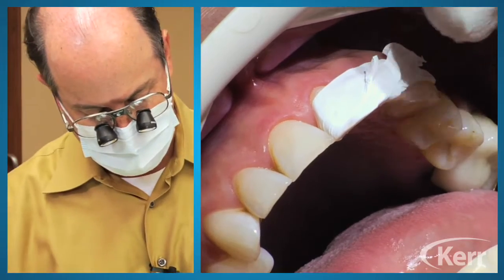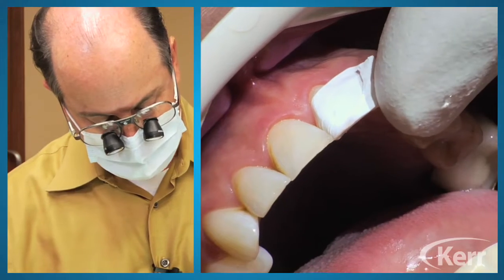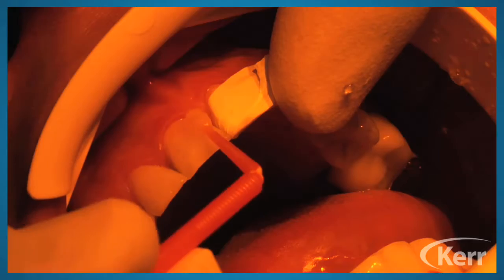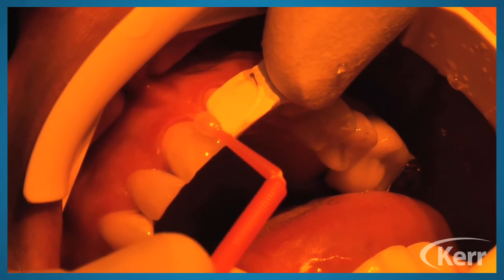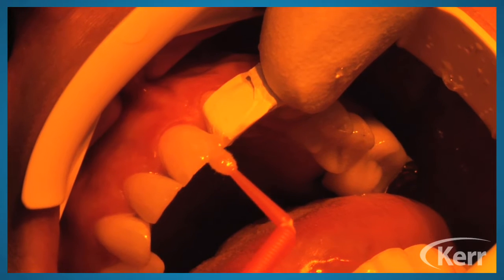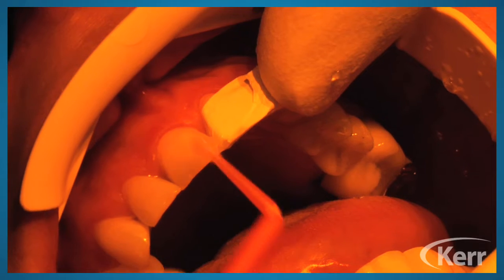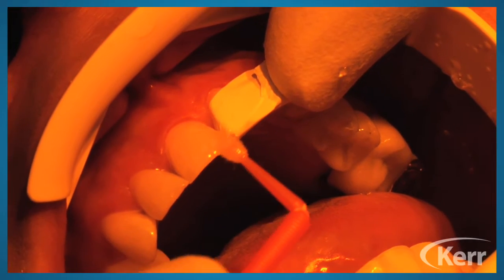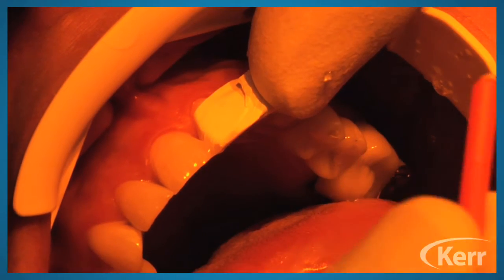So I like to rinse the etch off very well. And now we'll use some Optibond Solo Plus. And actually, I'm glad I watched Edwin. Actually, he tore that out of the wrapper. And that's something very important. The etch, I hope you could tell that the etch pattern, I didn't point it out to you, but I should have showed you that the etch pattern was well beyond the bevel. And that's really important when you're doing these restorations, is etch beyond the bevel. And this material we can carry down a little bit beyond our bevel. And I say finish it to infinity.